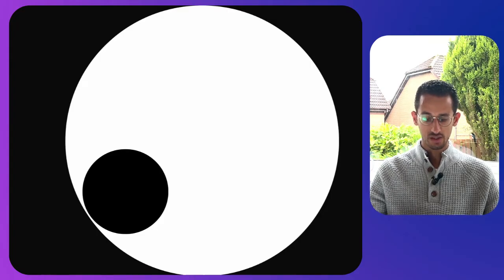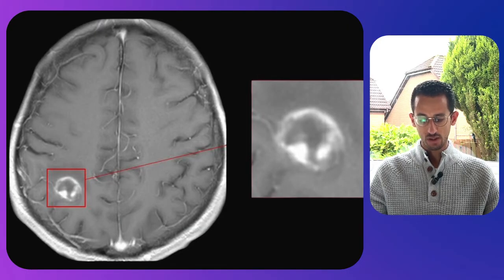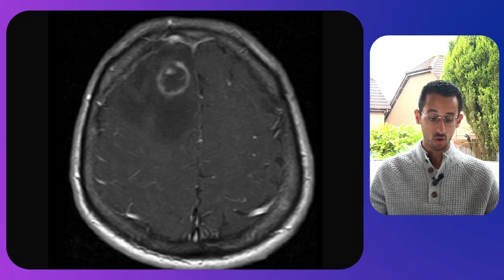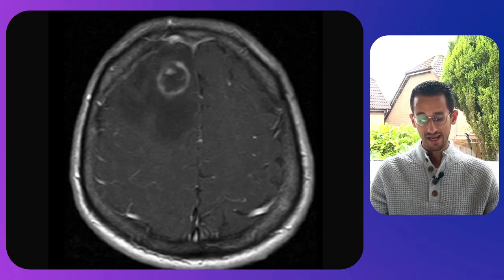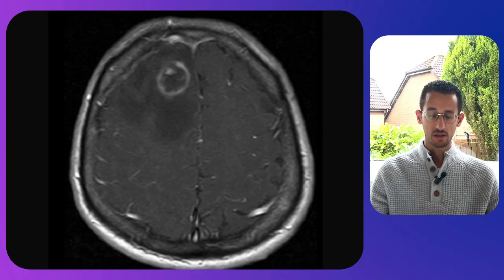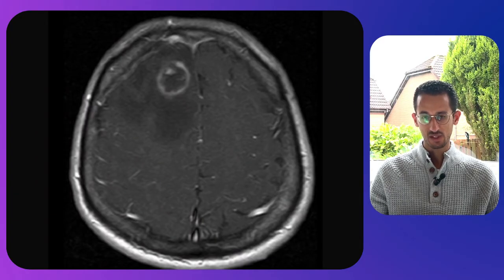Next is an eccentric target sign. In brain imaging you can see a target with an eccentric mural nodule, with surrounding edema. This is pathognomonic for cerebral toxoplasmosis and can be seen on post-contrast MRI or CT scan — basically a ring-enhancing lesion with an eccentrically located mural nodule, believed to represent an extension from the abscess itself with inflamed blood vessels.